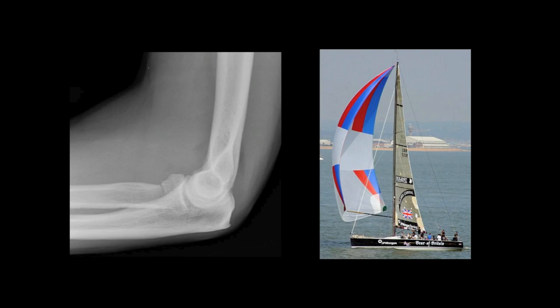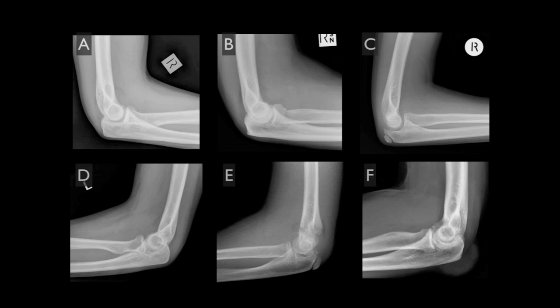The triangular appearance of the displaced anterior fat pad has been likened to that of a sail, and for this reason it is often referred to as the sail sign of elbow joint effusion.